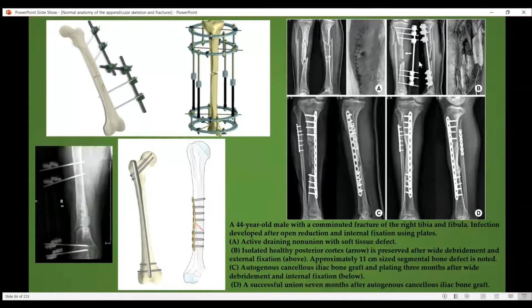External fixation devices are fracture reduction devices which are fixed from outside. There will be no open surgery here, but the devices attached are put from the outside environment. But this is after a few days.